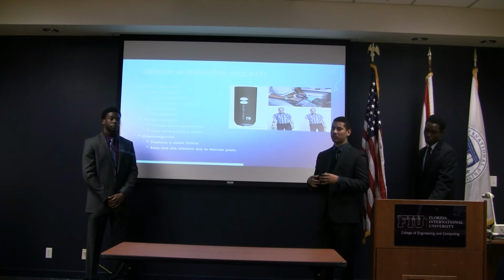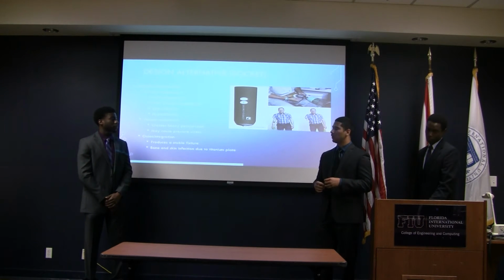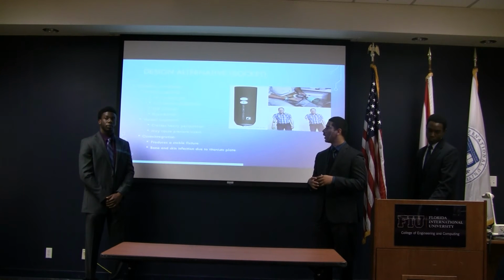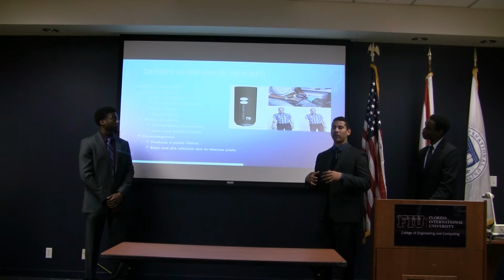However, due to the material used in this type of method, it has caused hyperhidrosis, skin irritation, and has proven to have poor thermal conductivity. Vacuum suspension deals with creating a negative pressure between the socket walls and the residual limb itself. In doing this, it prevents motion between them both. However, in this method, there is high pressure from the vacuum itself. This high pressure creates heavy perspiration, and combining this heavy perspiration with shear forces causes pressure ulcers.